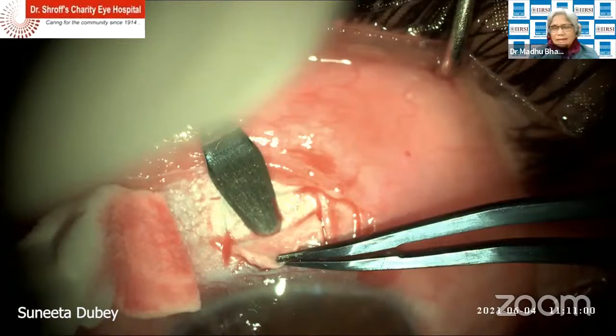And actually, there's nothing wrong with a crescent. I use both of them. It doesn't really make a difference, Ganesh. If you use a crescent, it goes into the cornea very nicely, and you don't have to go by the sides, so saving those sides, the leak is saved. Make it a little rounded. Don't go till the limit. I agree, but again, a millimeter before that, and make a very nice rounded thing. And believe me, I use all the phaco instruments. With a 2.2, you make a small entry and take a punch. So all the cataract instruments can be used.